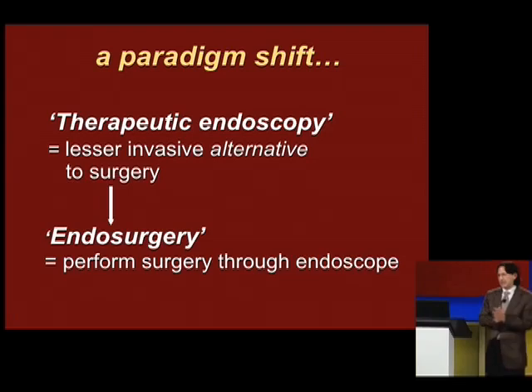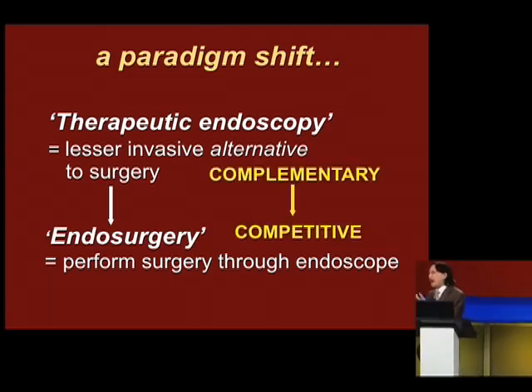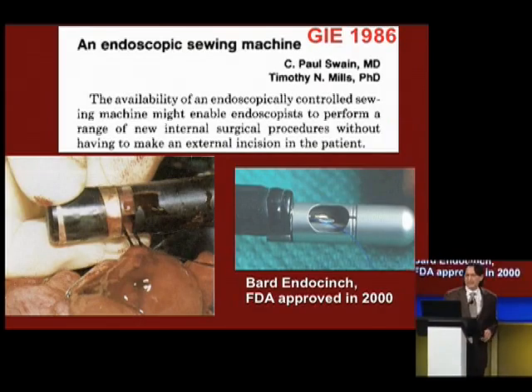A shift from the concept of therapeutic endoscopy, which was promoting a lesser invasive alternative to surgery, to endosurgery. That's using the endoscope as a tool to actually perform surgery. It's also a shift from a concept of complementary to surgery to competitive with surgery.